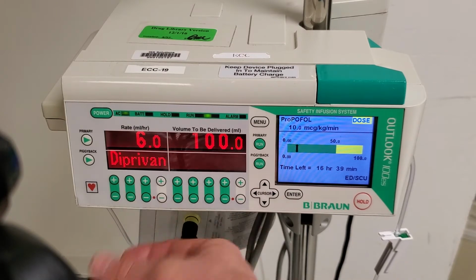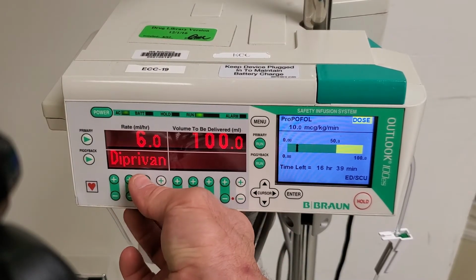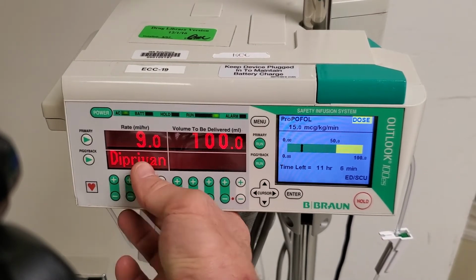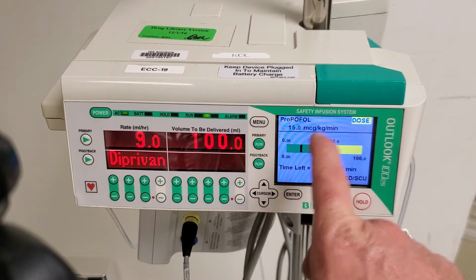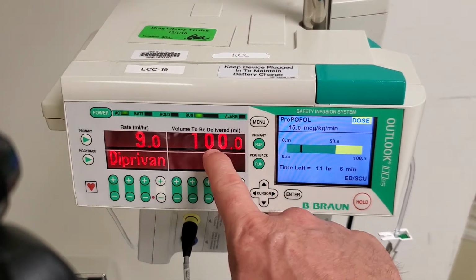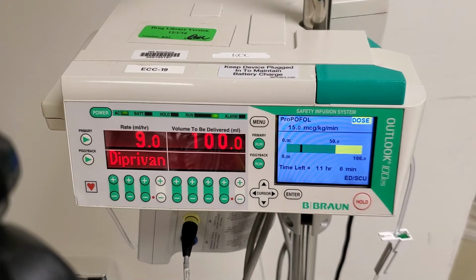You can change the rate and watch how the micrograms will change as I change the rate. So we're up to 15 mics. Always hit run after you make a change on these screens. 15 micrograms per kilogram per minute is a rate of 9 mLs an hour. With 100 mLs to be delivered, that gives us 11 hours and 6 minutes.